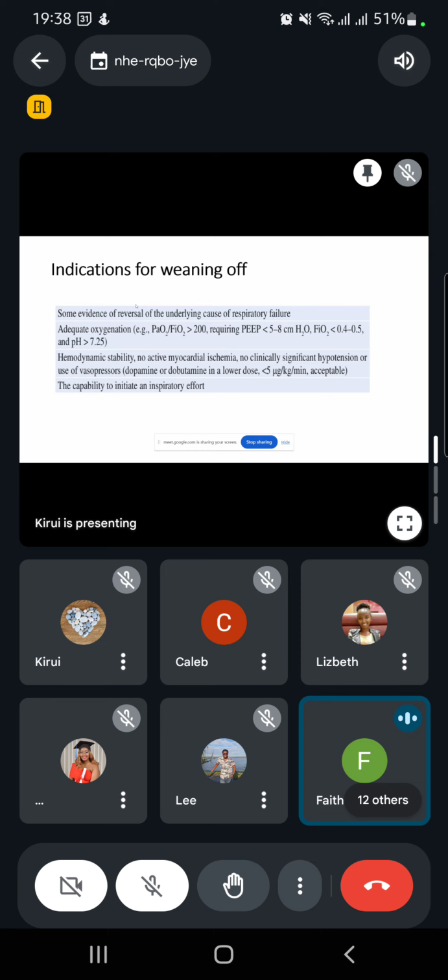the introduction to mechanical ventilation. How different modes are used will be discussed when you're covering mechanical ventilation in ARDS and the other topics. Any question?